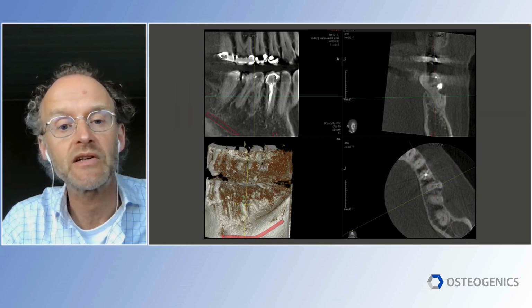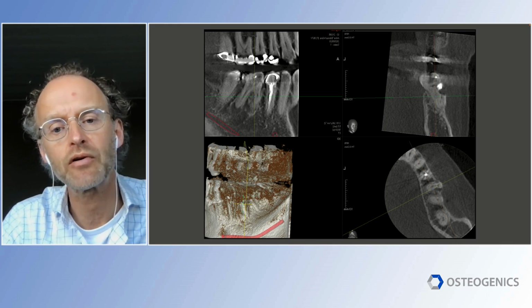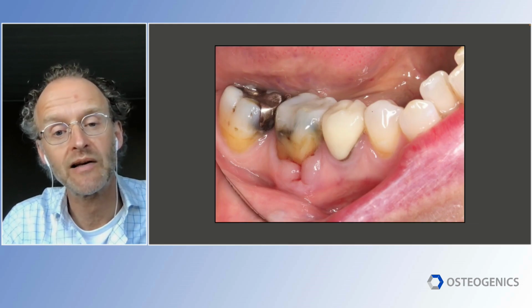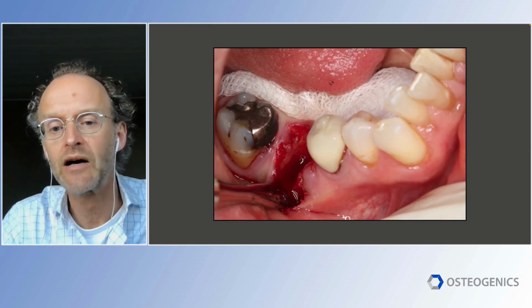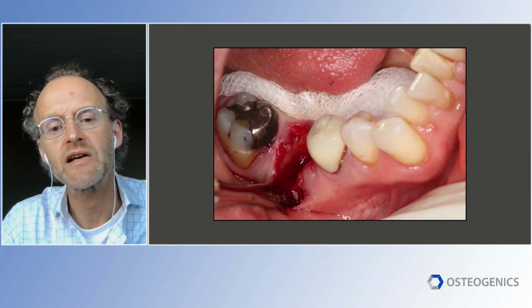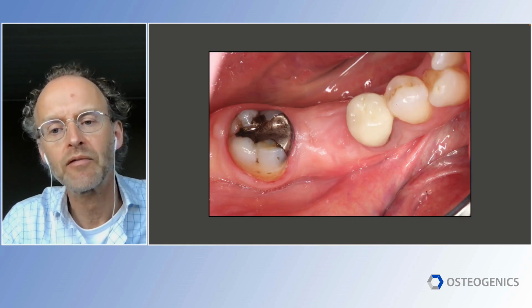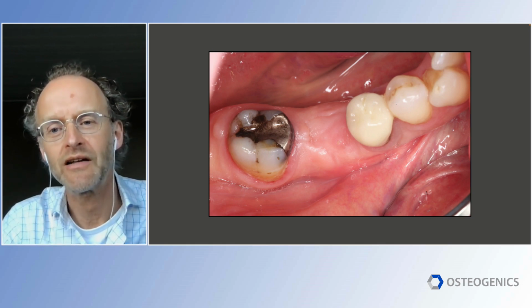Or another patient from this study with a lot of decay and also bone loss on the buccal side. Here we see the clinical view, a cleft already, clinical attachment loss on the neighboring teeth, not a very positive sight, but still it's tempting. So we take out the tooth carefully. You see the bone loss here on the buccal side. You apply this technique, and after 5 months, the fun part can really begin.